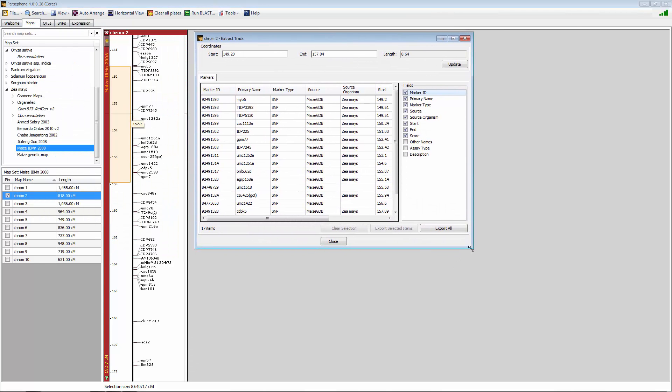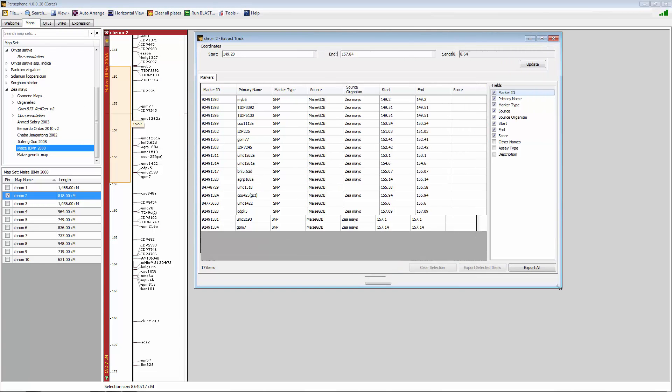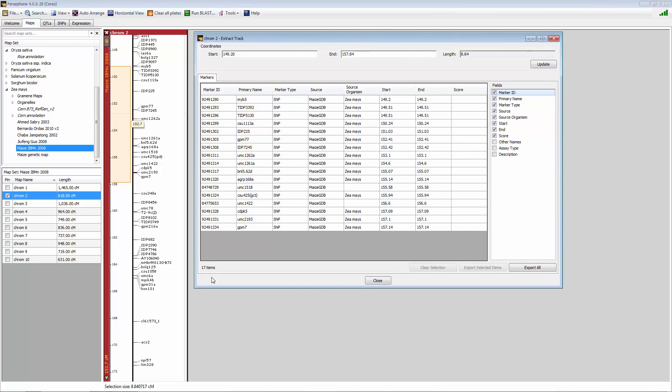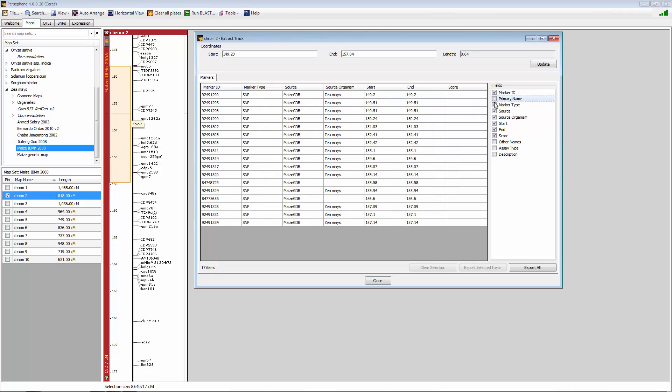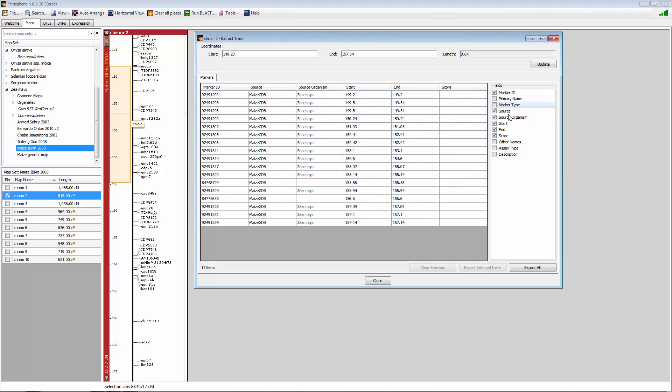And now it brings up all markers within that region. So 17 markers and a variety of information that you can add or subtract if you're not interested to export and move offline to other applications.